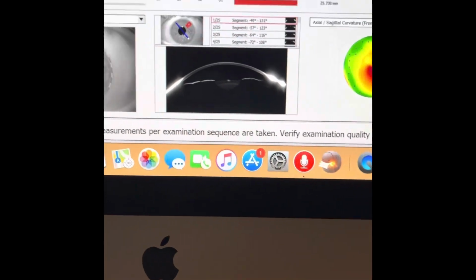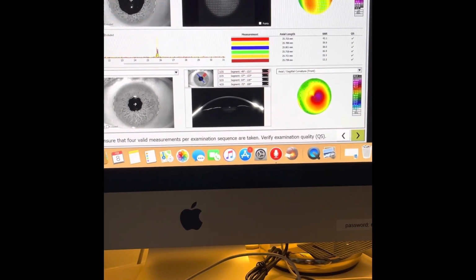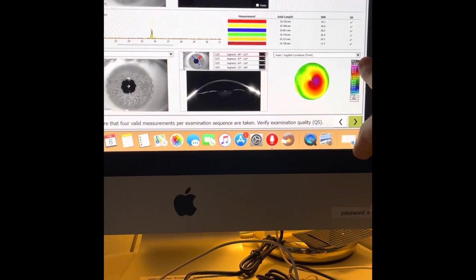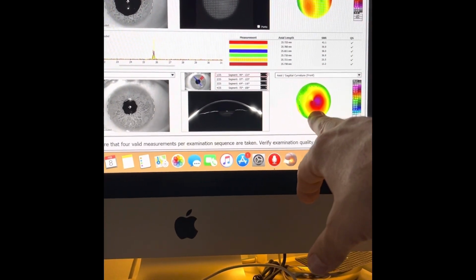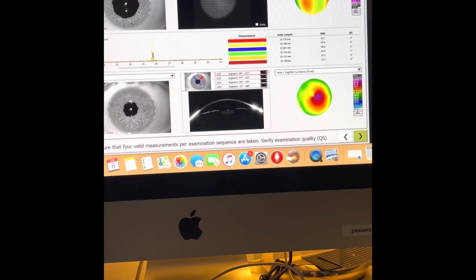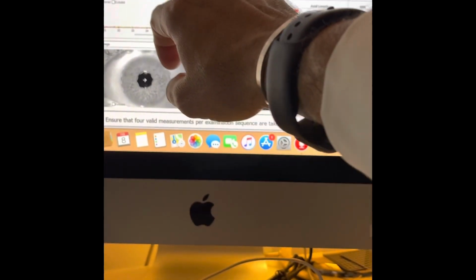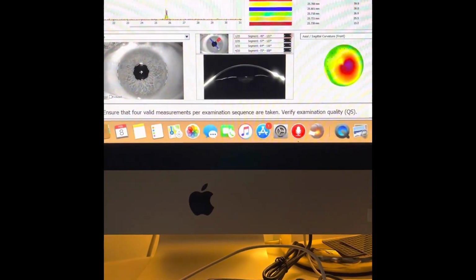These are the numbers with the ray tracing software Innovize that we have for the first time globally used, and it's currently in print in the Journal of Cornea, to treat in conjunction with CXL for an enhanced Athens protocol using ray tracing. We can see here that the beauty with the Innovize software is that despite it trying to fix the cornea curvature with lasering the surface of the cornea, it takes into account the significant coma the posterior cornea curvature establishes as well. And another caveat with the ray tracing software is that it deals in a keratoconic patient as if the cornea is tilted, since the ectasia is infratemporally tilted. So it treats most of the irregularity as tilt and not necessarily as removing the bump on the cornea.